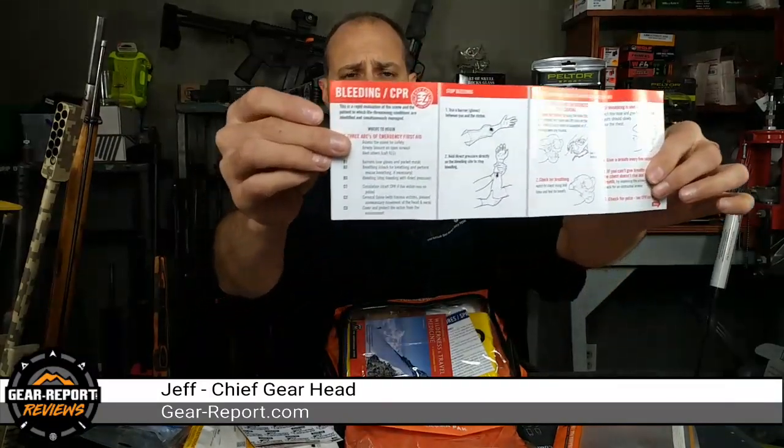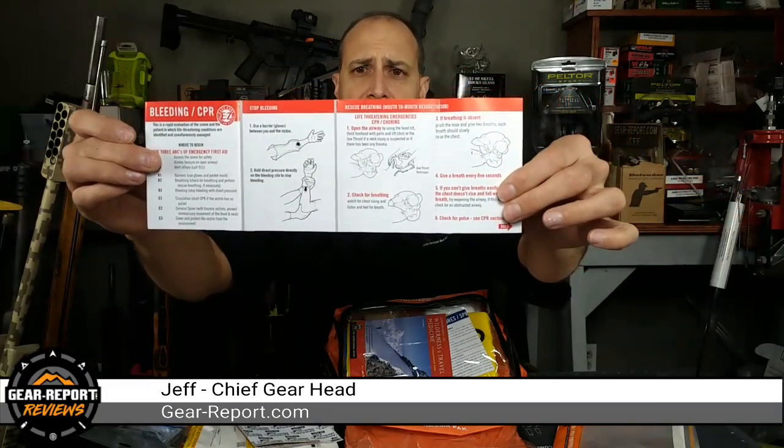CPR breathing barrier. Now, I typically have a larger plastic mouthpiece thing that goes over the face that I carry. But if you don't have it, these little plastic one-way valve barriers are super light, easy to carry, and useful to protect you and the other person. Hey, we don't know what you have, right? So it's not just about protecting you. Again, I love that they have the information card in here.